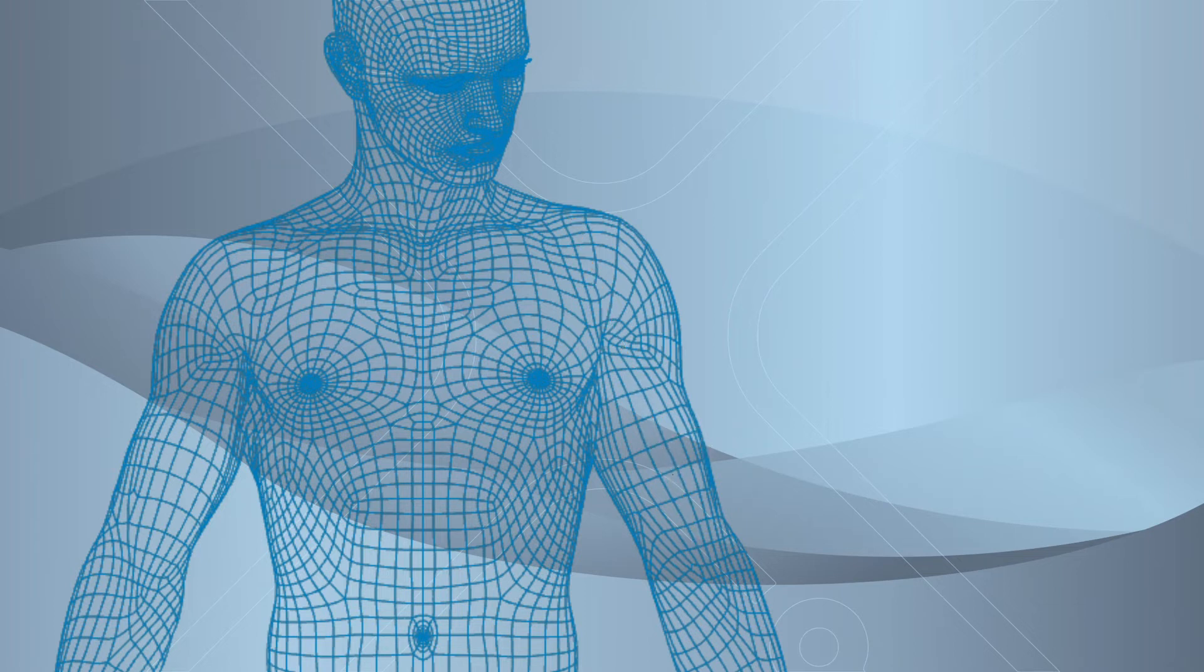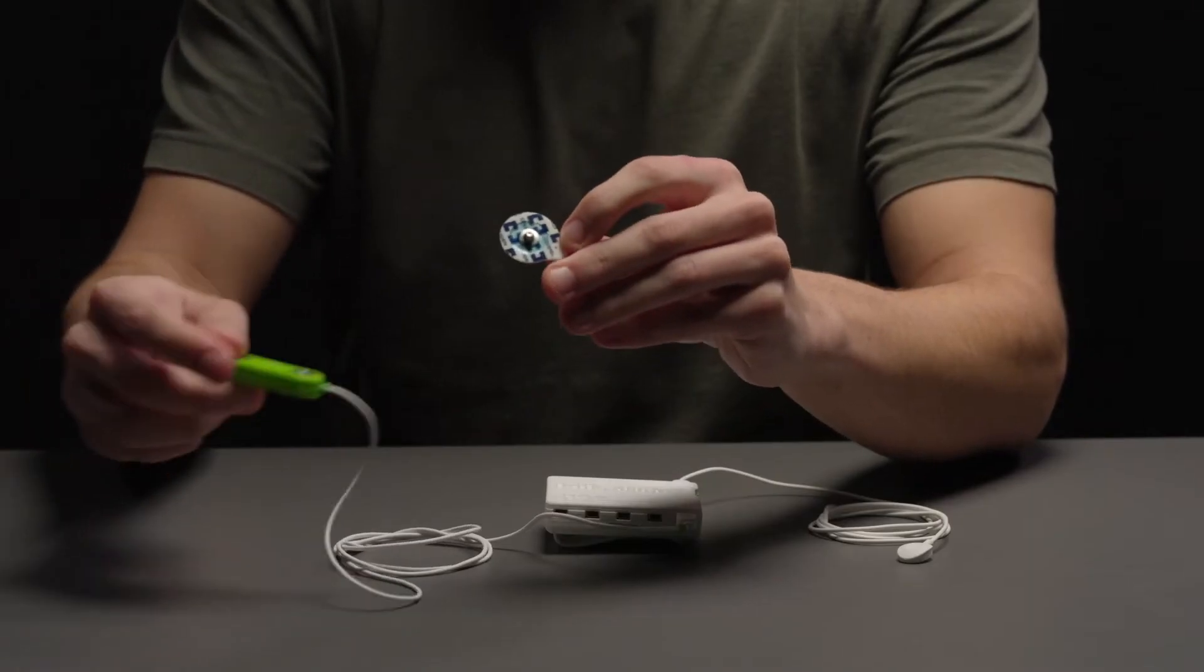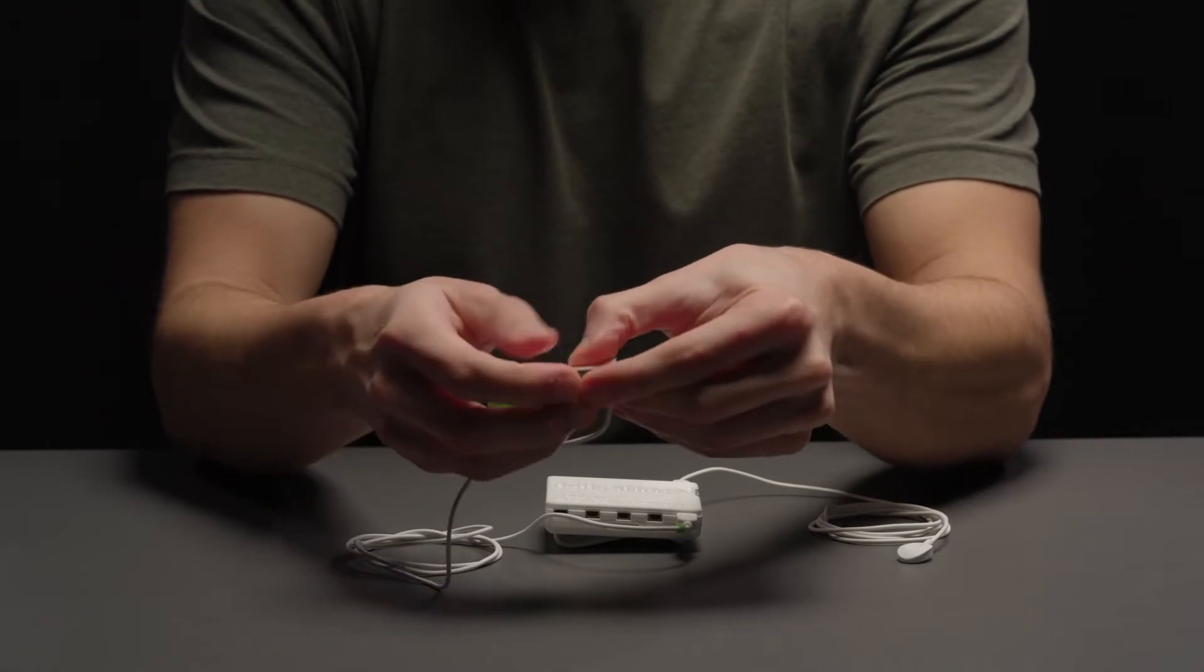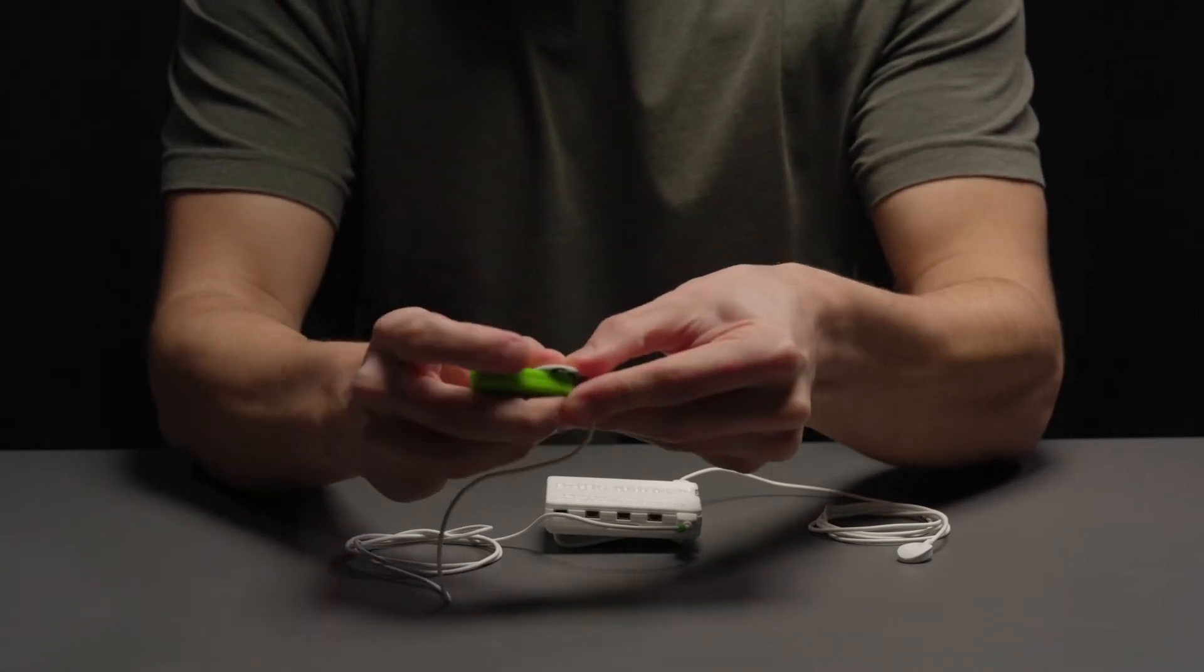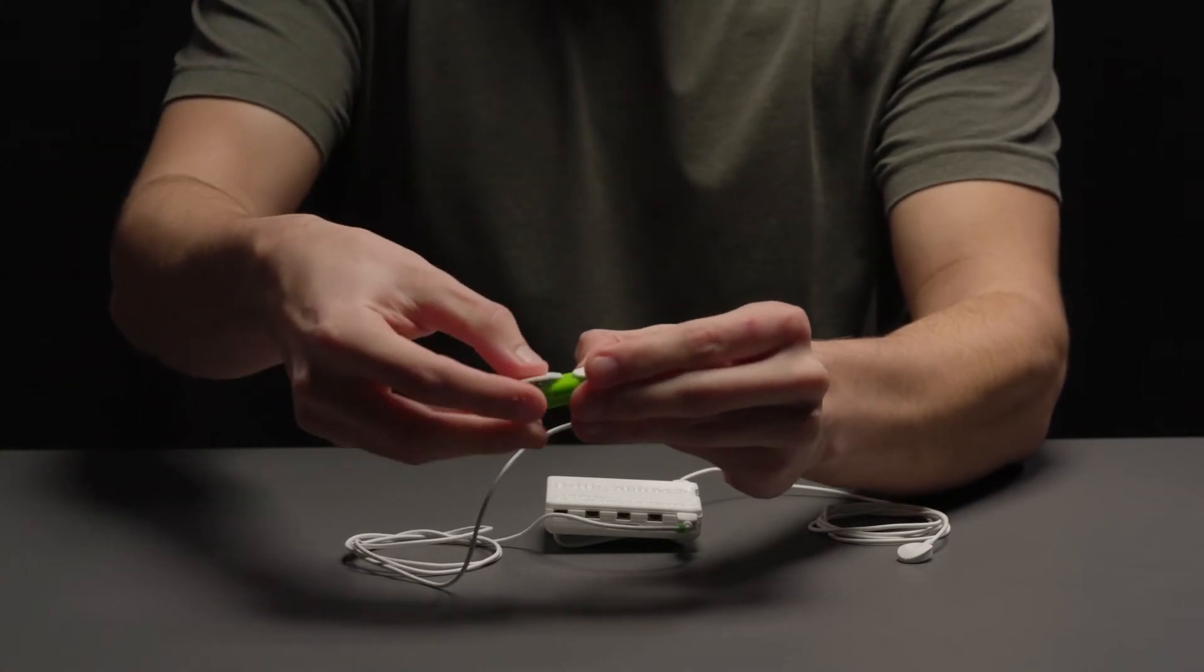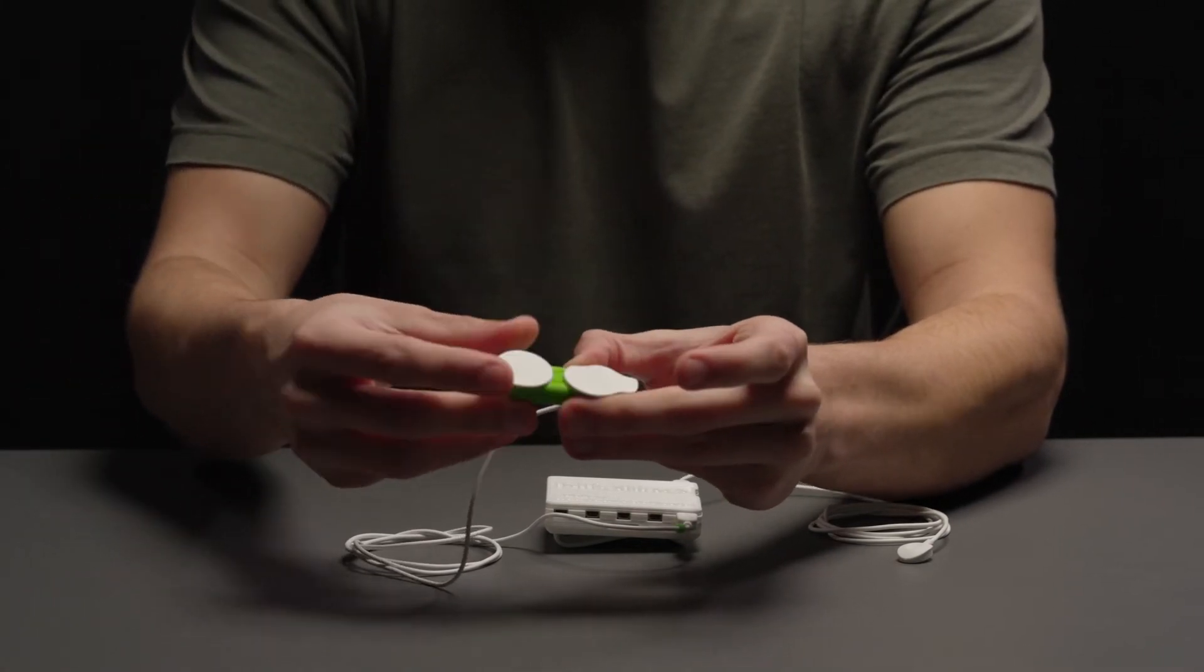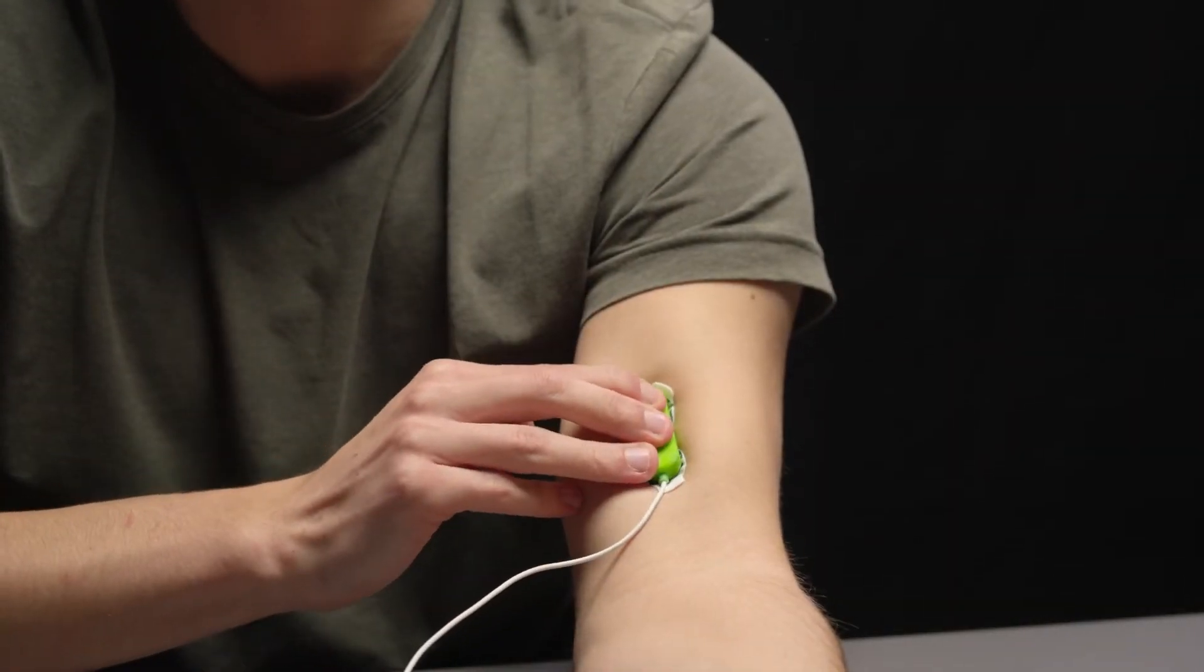Now, before placing the two measuring electrodes, we need to disinfect the skin to make sure all oils and dead skin cells are removed to improve the skin connectivity. Then, let's take a new pair of electrodes and connect them to our sensor cable and then place them on this position.